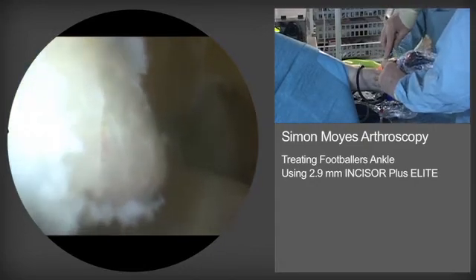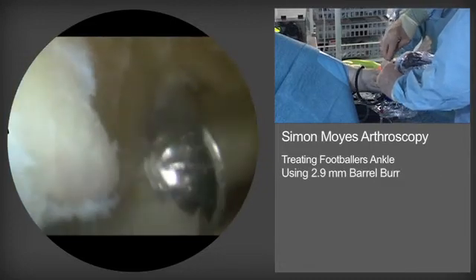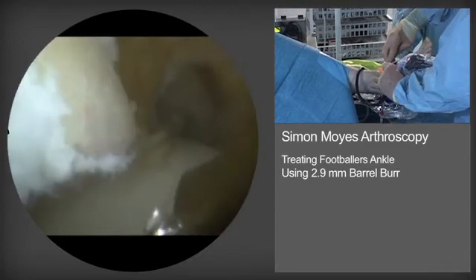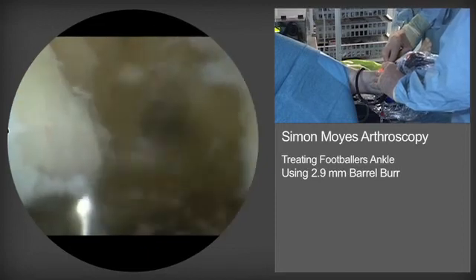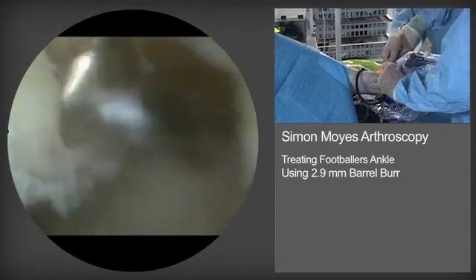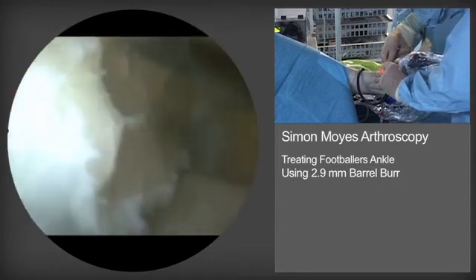The burr is being reintroduced now. We're viewing across the distal tibia anteriorly with the 30-degree arthroscope angled. The last remnants of the tibial spur are being resected.